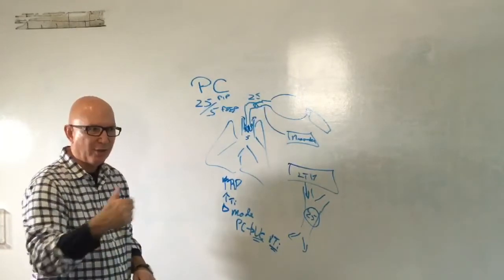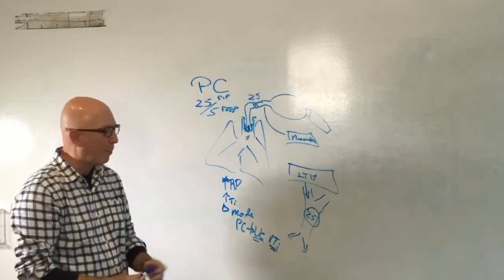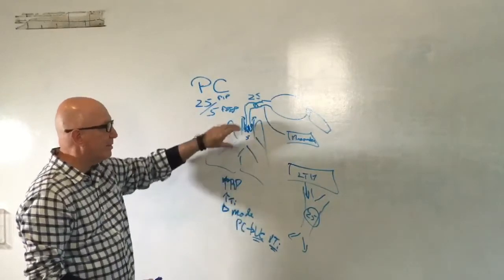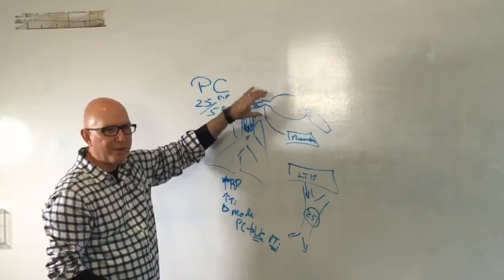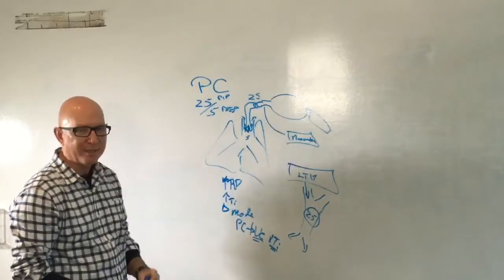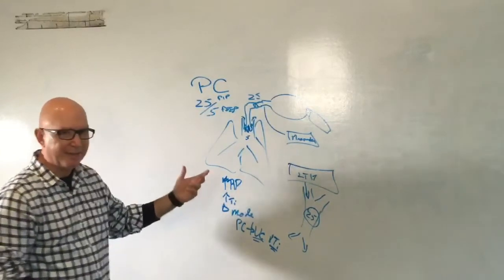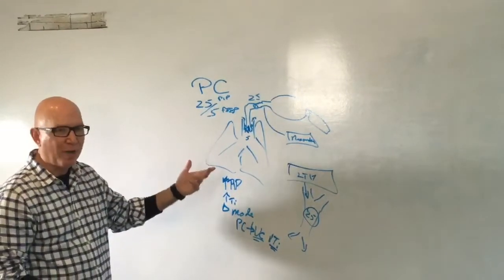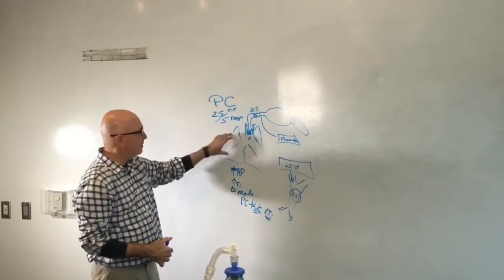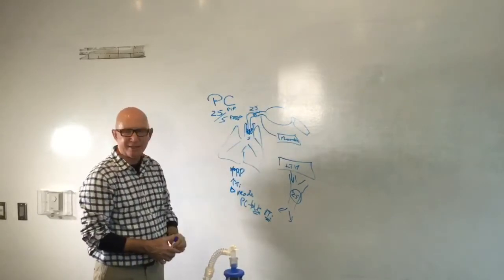Now, within the context of Ornge, we're using those T-piece resuscitators now, which we're teaching in this year's CME. And those may get you where you want to go. However, again, you can't accelerate the flow in the same way with that T-piece resuscitator as you can with a resus bag itself. So again, I trust that explained or gave a few options to the individual that asked that particular question. And I think at the end of the day, I believe that you manually ventilated this child, which may be the only option that effectively gets the volumes in.